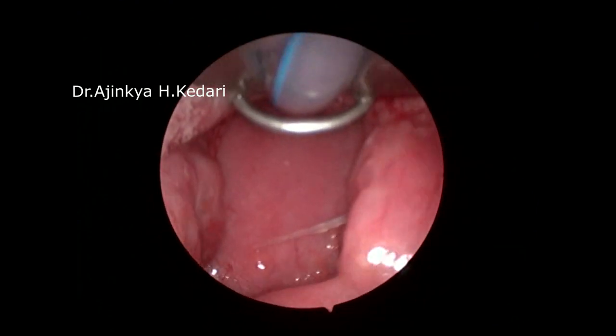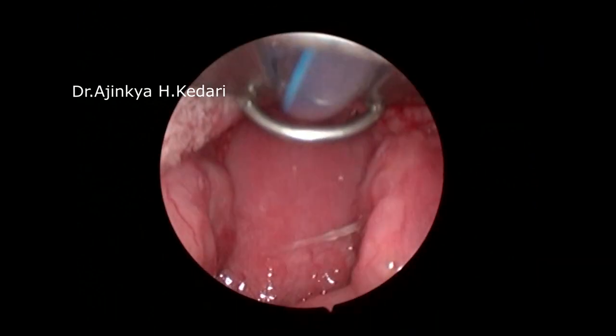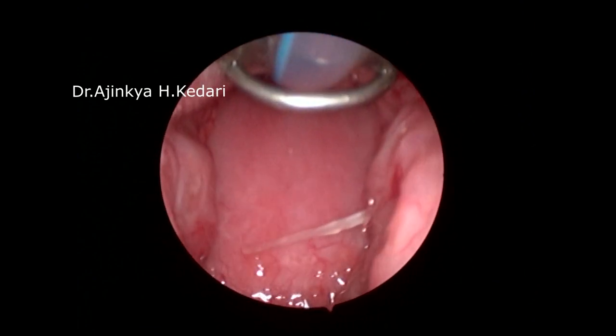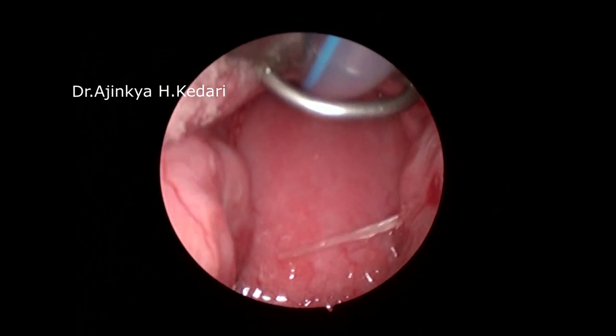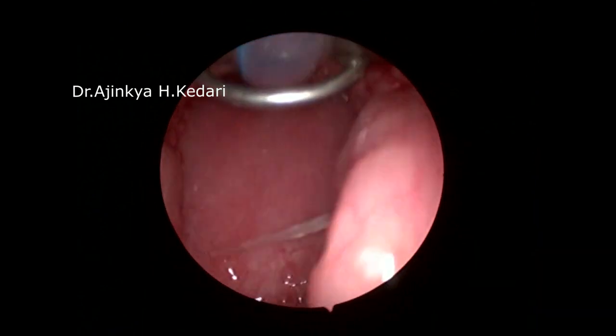What I did was perform an endoscopy in a conscious small kid, where I could see a fish bone lodged within the right tonsillar area. So I decided to go for removal of the fish bone under general anesthesia.